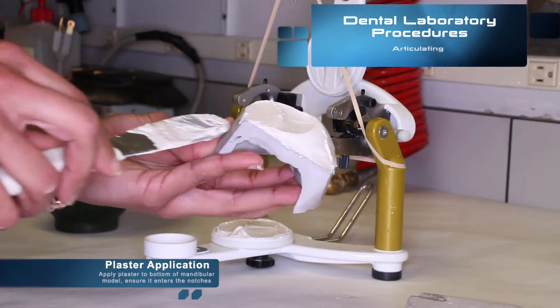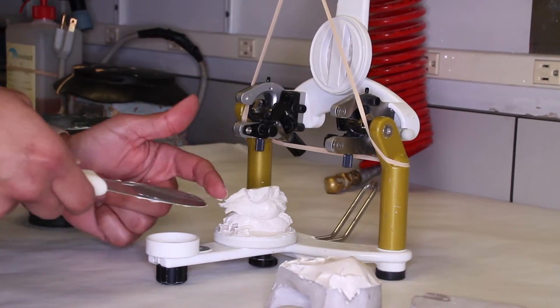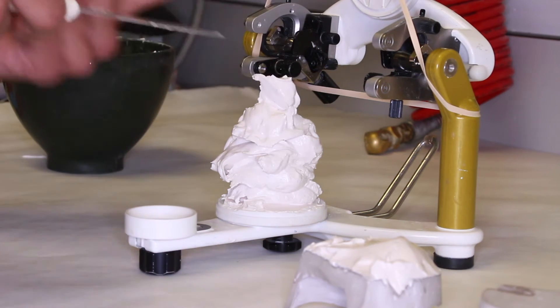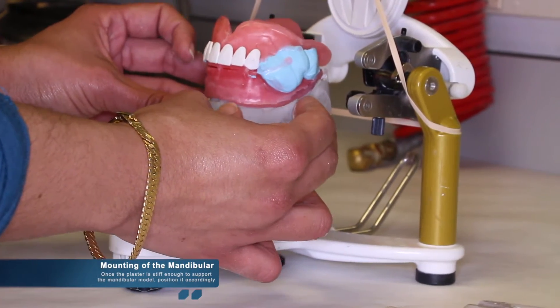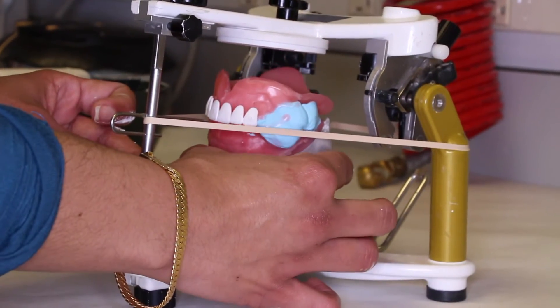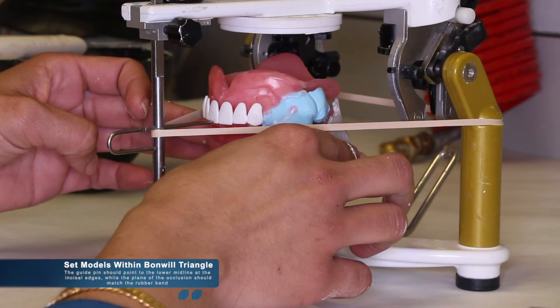Once ready, mix your plaster and apply it to the bottom of the mandibular model, ensuring that it enters the notches created on the base of the model. Then take the plaster and stack it high enough to support the model at the height of the rubber band. Once the plaster is stacked high enough and stiff enough to support the mandibular model, it can be positioned accordingly. It should be noted that the maxillary cast is not in position at the moment, as it could add extra weight and cause the models to slump as you start positioning it on the plaster. The model should be set within the Bonwill triangle.